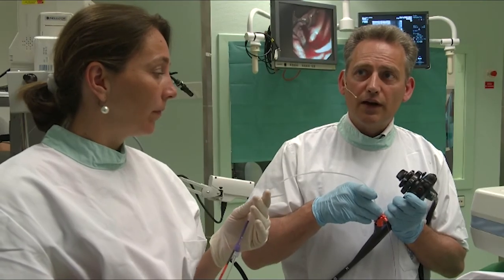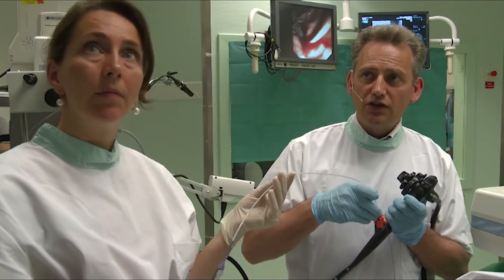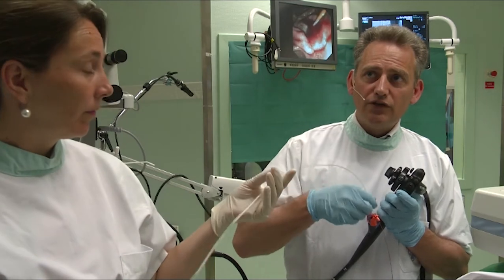We close the brush. You see this happening now, and this is something we will repeat a few times in order to get a good sample for cytological evaluation. Open. So now we're done with the diagnostic part. We've done an EUS. We have got the cytology samples, and now we have to deal with the stricture.